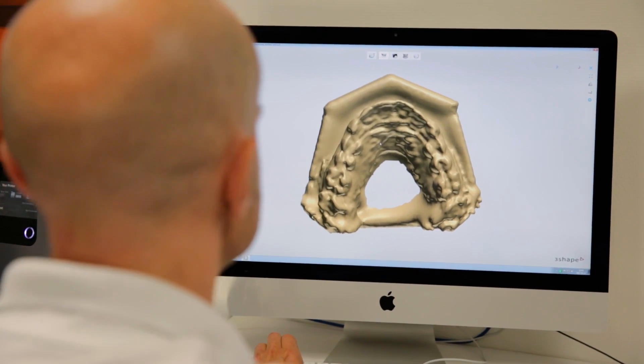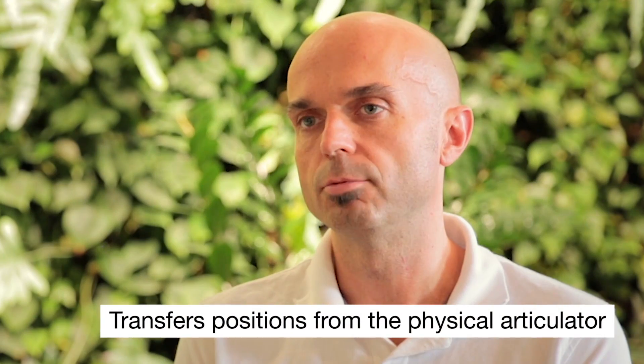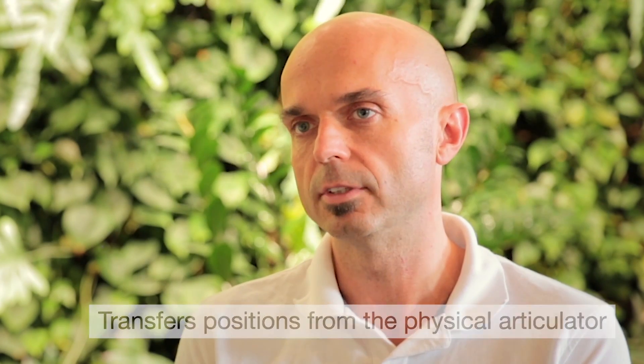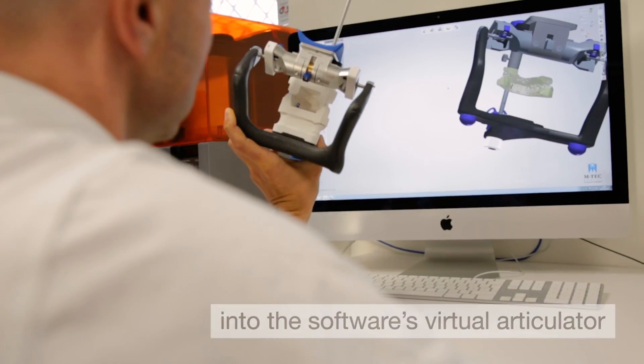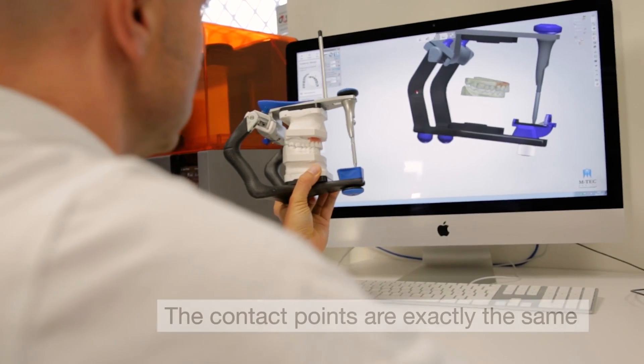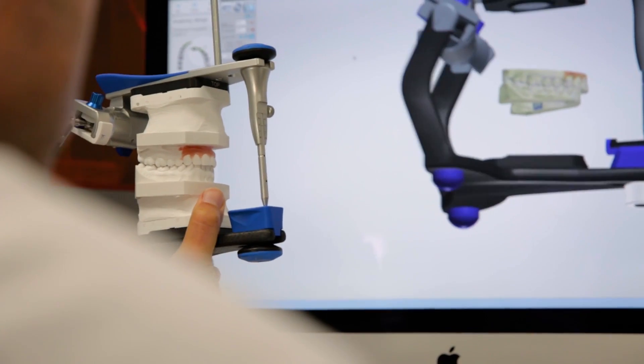The benefit is that what we see on the screen is what comes out from the machine. So we know that if we have a very nice occlusion on a case in the virtual world, and when we mill it and test it in the physical world after milling, the contact points are exactly the same as in the virtual world — and that saves us a lot of time.